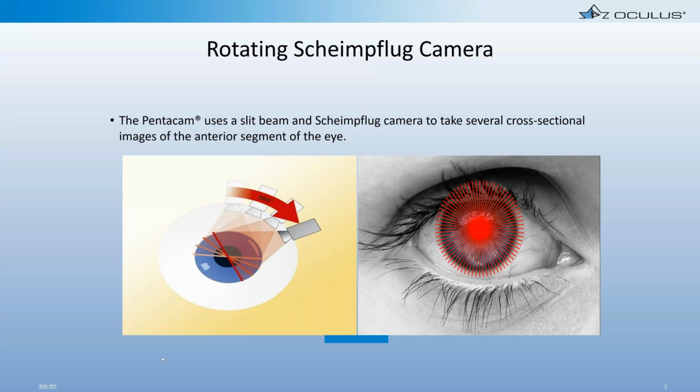Going back, I've been doing Ortho-K for maybe 20 years. I recall that in the early days, we used corneal topography, and corneal topography is great. I have a keratograph in my office that we use all the time too. For many years, I used my keratograph, my Placido disc topographer, to do my Ortho-K work. And again, it's very effective. It has great application. I still use my keratograph every day with my Ortho-K patients.